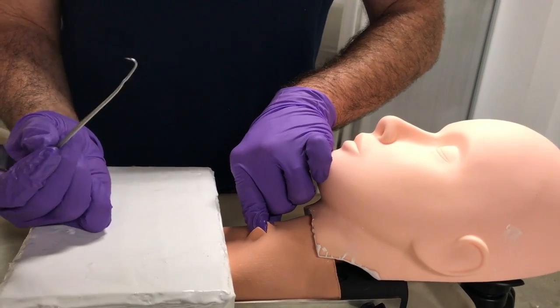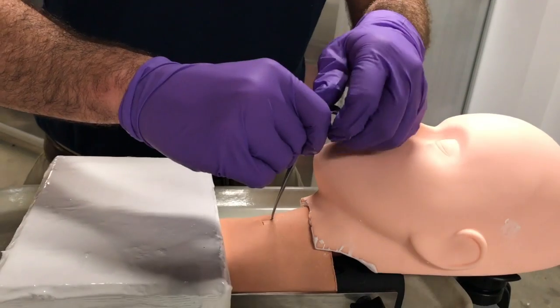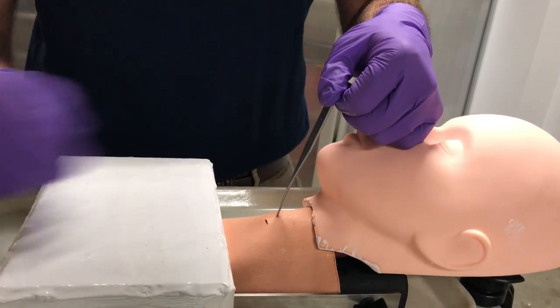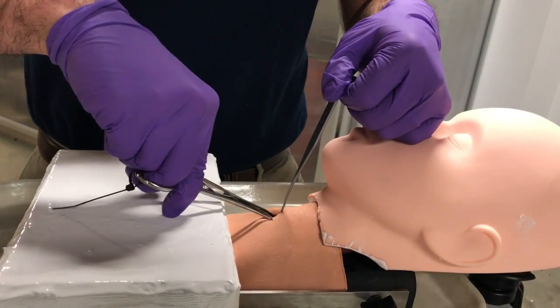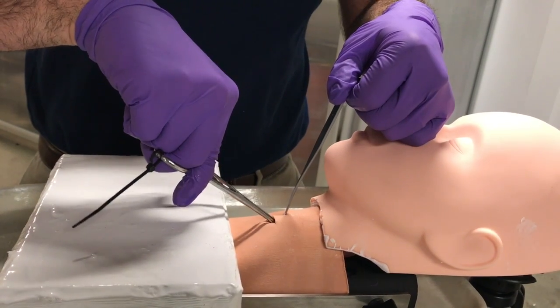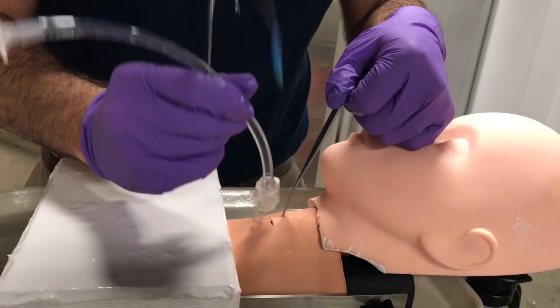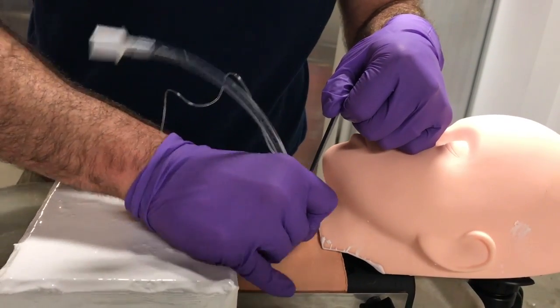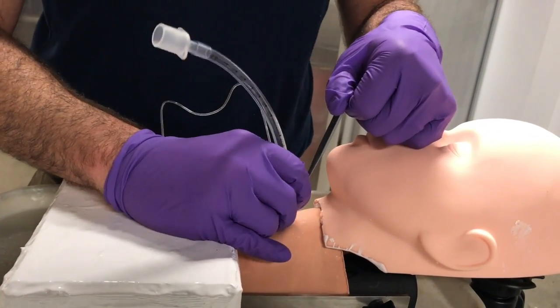The classic cricothyroidomy uses a trach hook that grabs the inferior portion of the thyroid cartilage. Then you take your dilator and dilate the soft tissue in the area, and subsequently place your endotracheal tube just beyond the balloon.